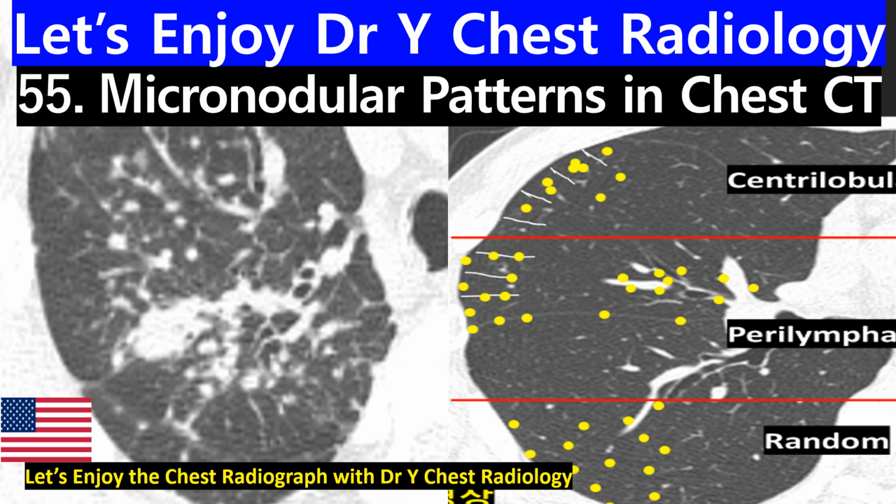Lesson 55. Today we're gonna talk about micronodular patterns in chest CAT scan. Let's go.